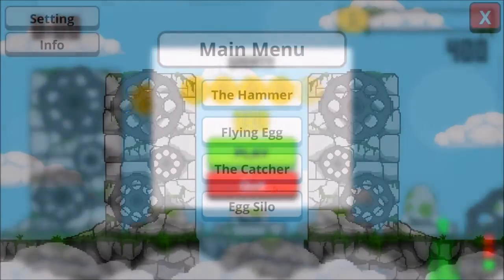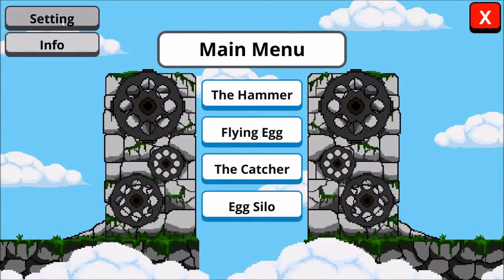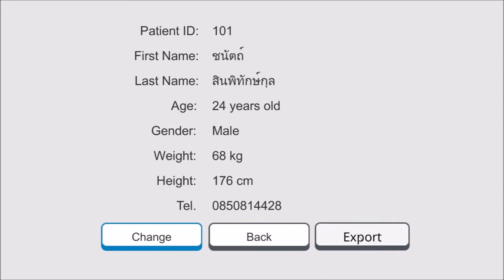Click the info button to display the user's information. This is the user information panel. You can change the user's information by clicking the change button.